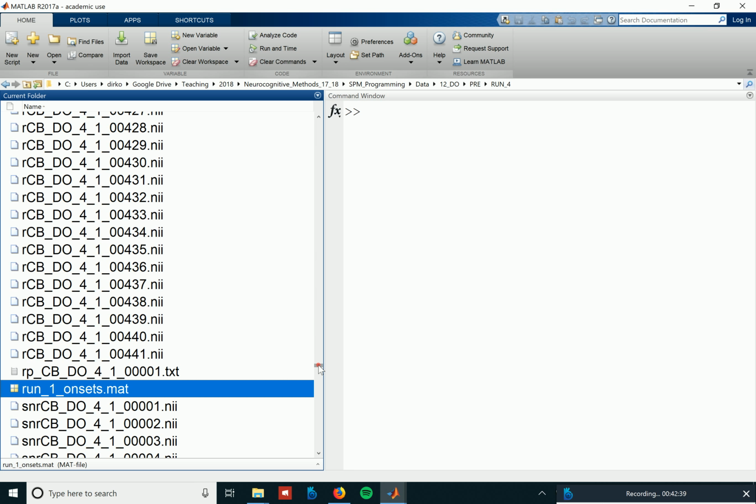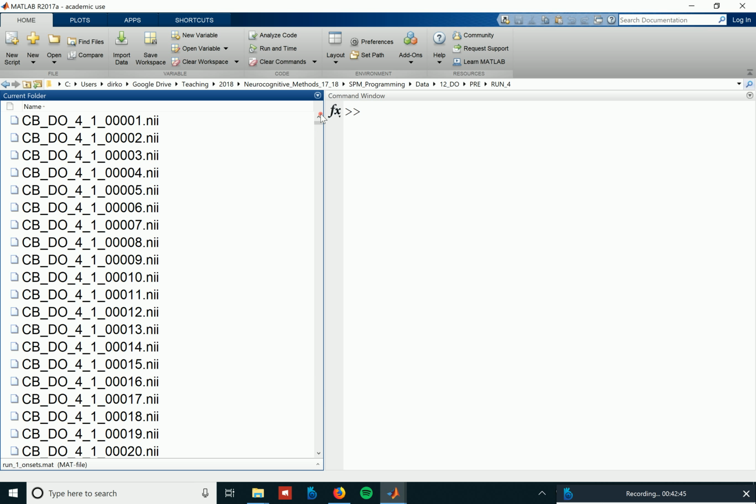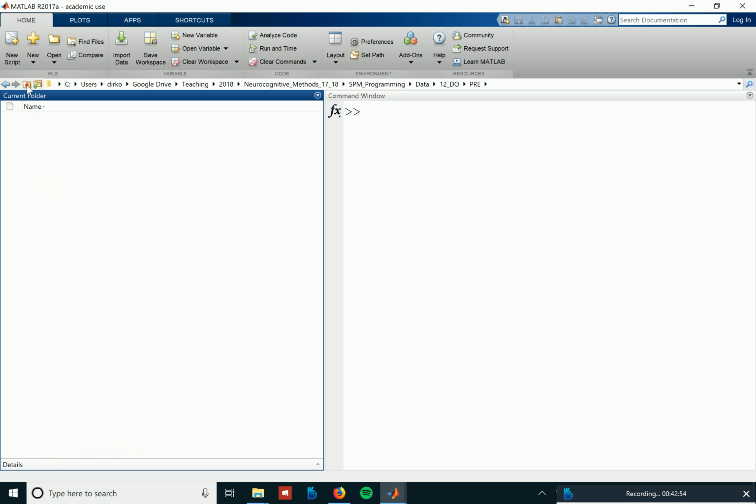What do I want to say? Don't know. Yeah, just work yourself into BIDS, and then you know where you actually need to put the event file, and then you are fine. It's really, really simple. It is actually really simple.